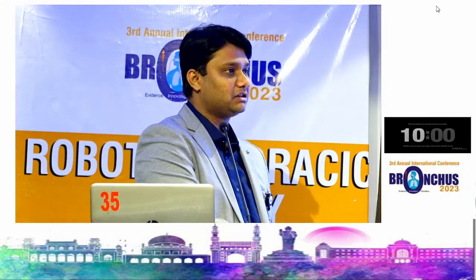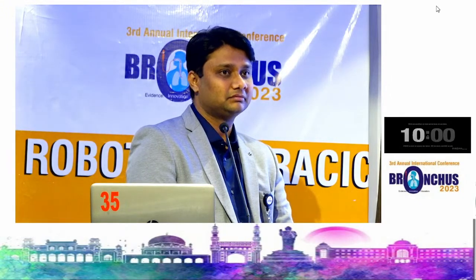No, I'll answer this question. Before starting any lobectomy, the first principle is to mobilize the whole posterior and anterior hilum. That is done in all cases, whether it is an aspergilloma or a lung cancer. Then I would prefer to take the artery first, but if the vein is more anterior and not obscuring the artery too much, I take the vein first because that will make my artery dissection easier. Of course, if you waste too much time after division of the vein, you'll have a congested lung.